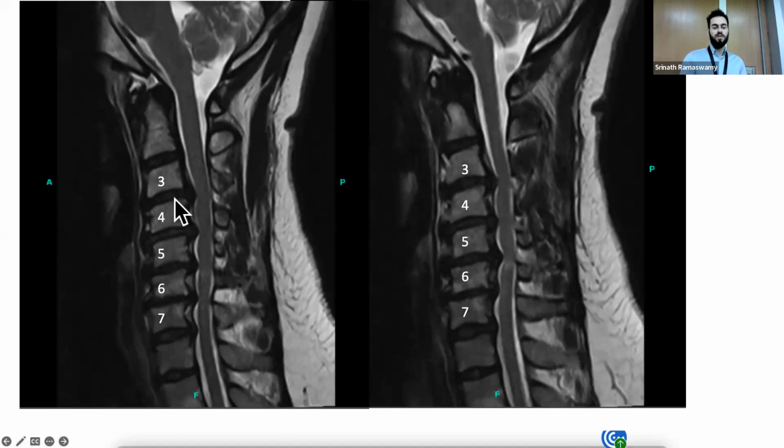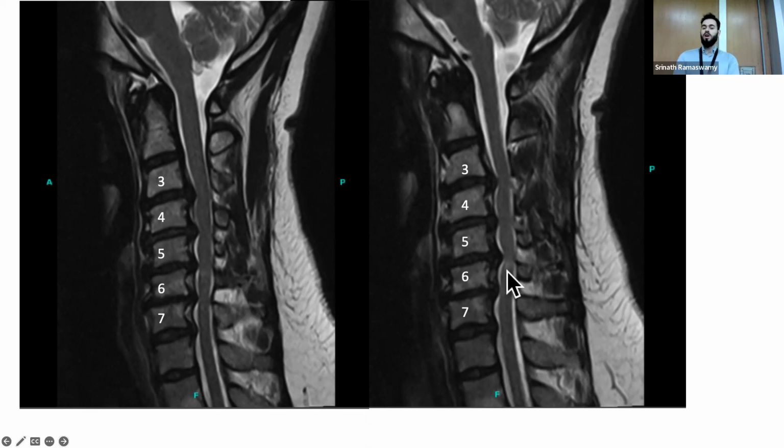Because at C3-4, none of your cervical roots have even exited, and all of your brachial plexus has to come out between these levels. And if you look at the level of stenosis that she has, you can even start to appreciate a little bit of whiteness here, more on this cut, which is myelomalacia, which is basically swelling of the cord. Water in the cord on the MRI means that it's swollen. Does it mean it's damaged? Maybe. Will it come back? Likely.